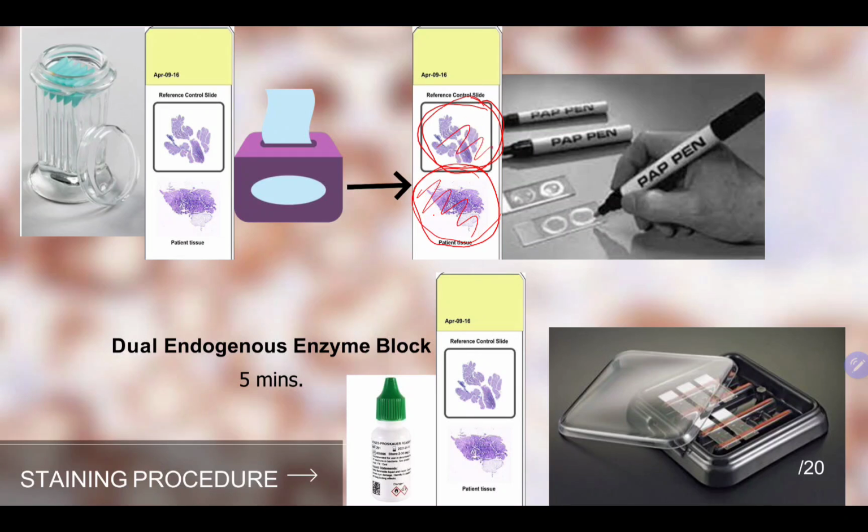Okay? So, after dito, yung sa water wash, wipe, then lagay ninyo yung Dako pen. And then, you're going to perform blocking. Okay? So far, nagawa na natin yung number 1. We have the antigen retrieval. Number 2, ito na po yung blocking na gagawin natin. Okay? So, sa blocking po, itong nilagyan mo ng Dako pen, dyan po mag-drop ng blocking solution.